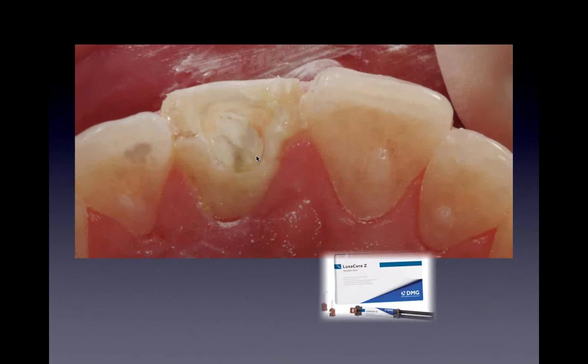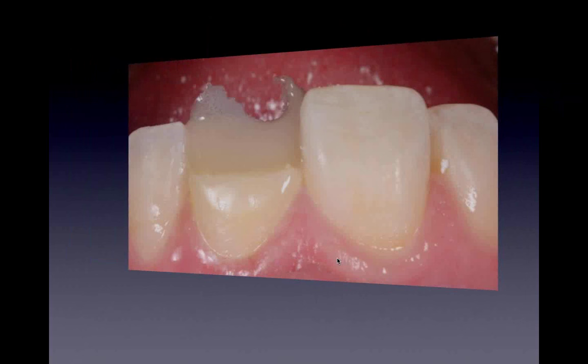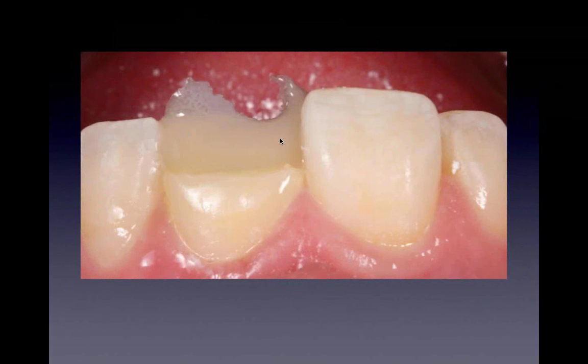So I'm going to prepare a little bit here, bring up the Luxacore, etch this whole thing, dent and bond the whole thing, and then here's my dent and bond after I etch. Then we're going to put Luxacore in there, even though I'm going to take it out in 3 weeks. So here's my Luxacore base. Now again, you can use a matrix for the back of this, you can use your finger, you can use a clear matrix, whatever you need to do to support this. So it's inside the canal and it's in the lingual part here. After this cures, we release it from the interproximals with a little blade.